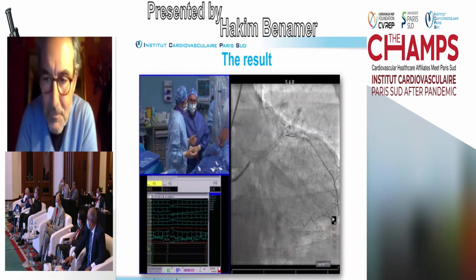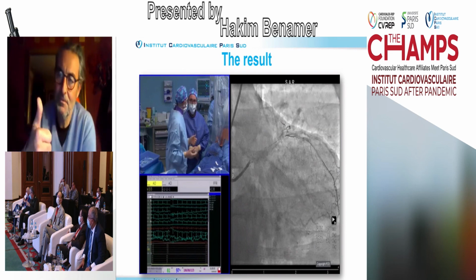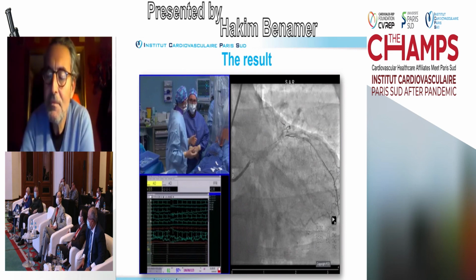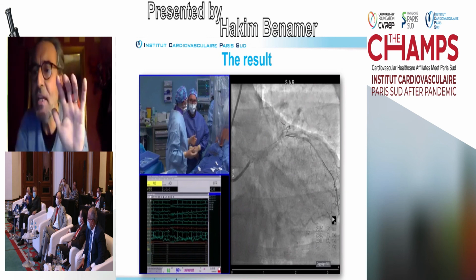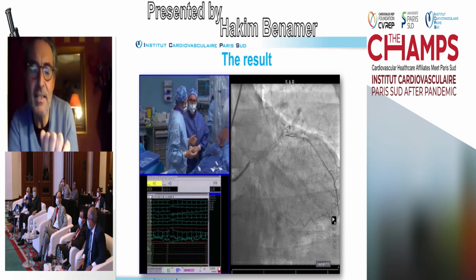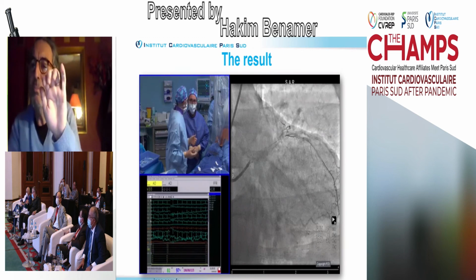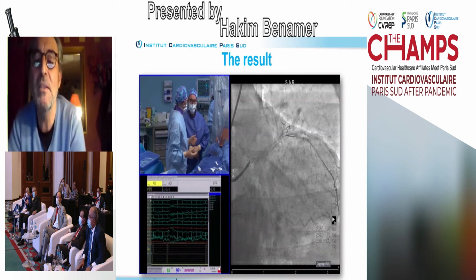Okay. Yes. So we will move to Dr. Bernard Chevalier, but I'd like to comment for the last one. Sometimes during such cases in the left main, you have longitudinal compression by the maneuvers. What are your tips and tricks to solve this problem? Left main control, that's very important. You have to remove the guiding catheter when you remove your balloons or especially the jailed wire. The left main control, that's my principal advice.